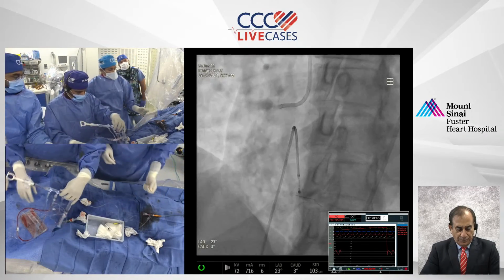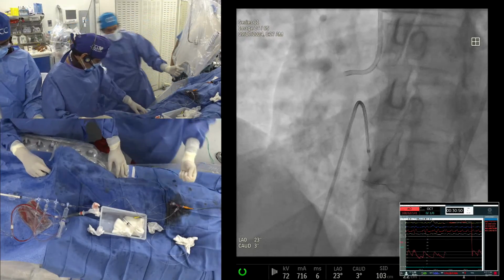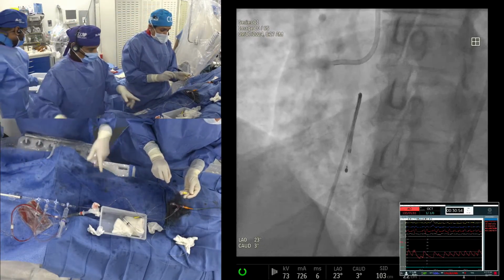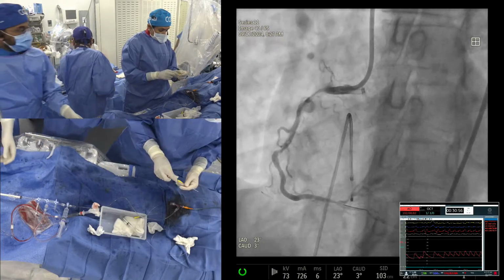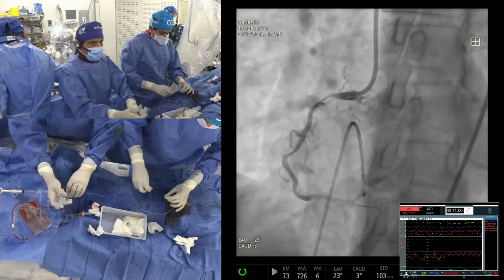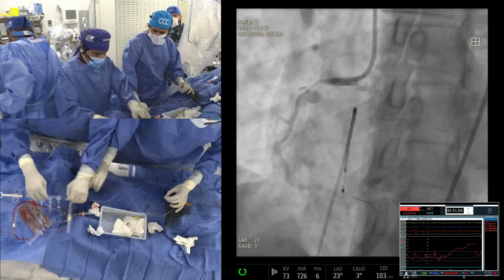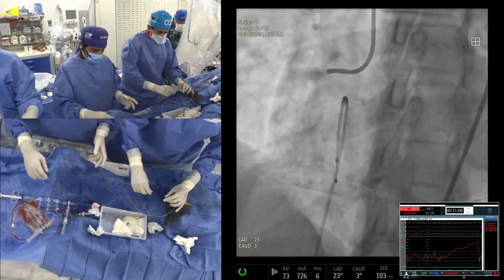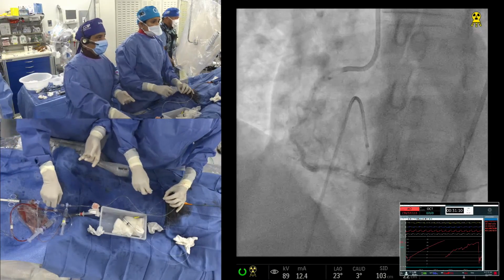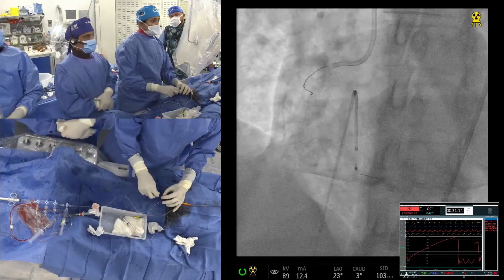Okay, let's go. This is telling us don't go distally. Look at the STs now. The vessel is okay. We are giving a little nipride, I'm giving a little verapamil. I love verapamil more than anything else, although people love nipride. There's nothing wrong in that.